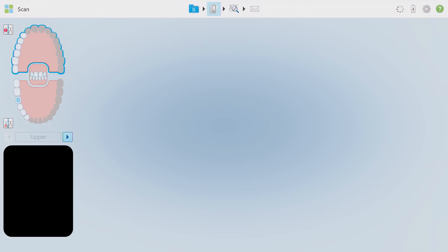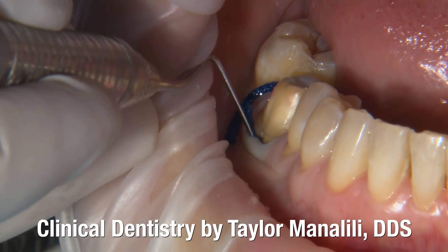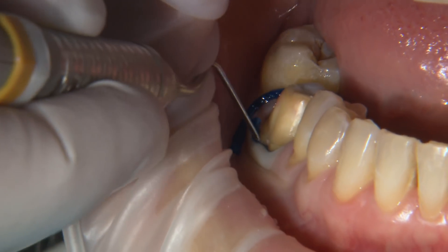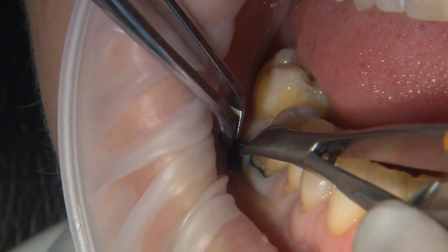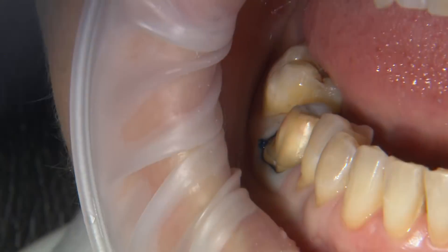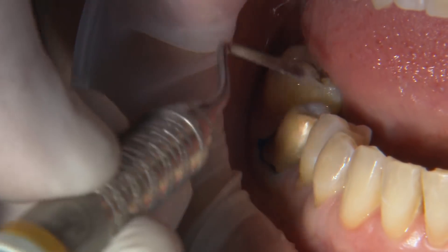Once my doctor's preparation is done, I want to quickly review two retraction techniques our dentists here at Gladwell Dental choose before scanning. Contrary to many rumors about digital dentistry, all other elements of the dental procedure must remain the same up to the point that the scan is taken. Tissue retraction is still a vital part of the process — for dental assistants that are an expanded function, this applies to you as well.